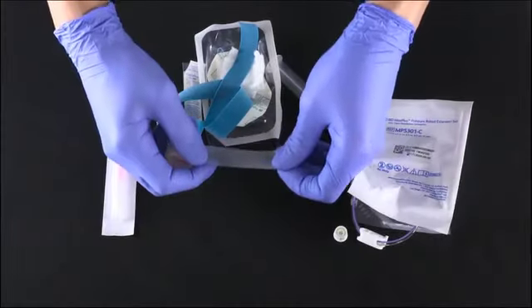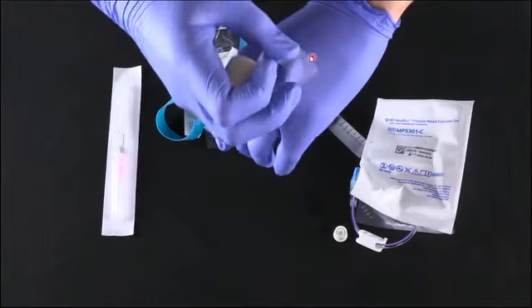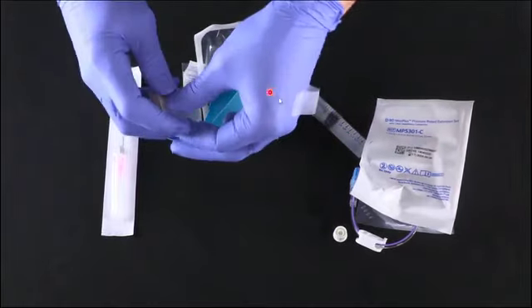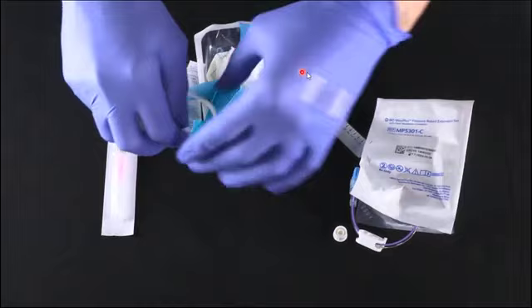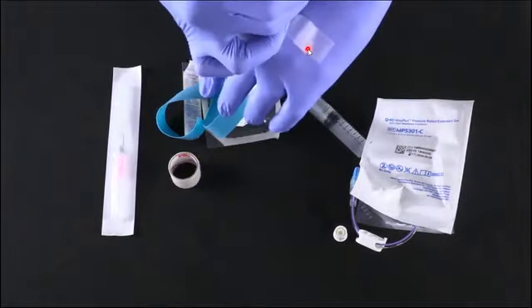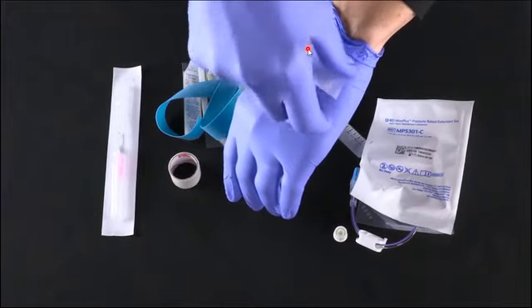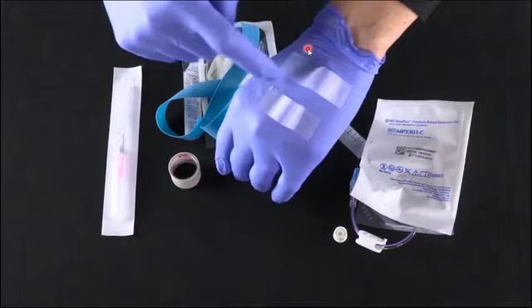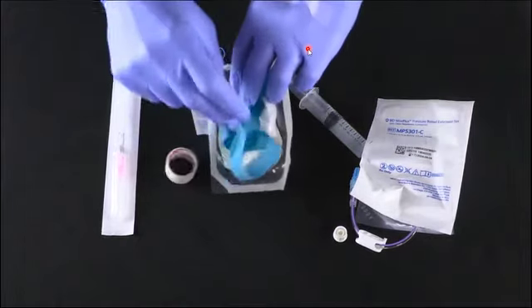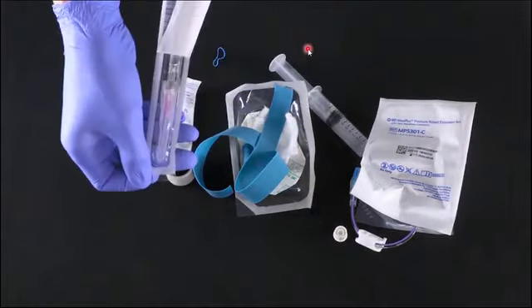Now, the next thing you want to do is grab your tape, and you want to do a couple of things with it. First off, you want to tear off two pieces, and you want to create this loop that you're seeing right here. What that does is it allows you to reach over and grab the tape really easily. The reason I put it on the back of my hand is because I want to make sure that, number one, I'm following best practice. And putting it on the bedside is actually going to grab all that bacteria. So this keeps it nice and clean.